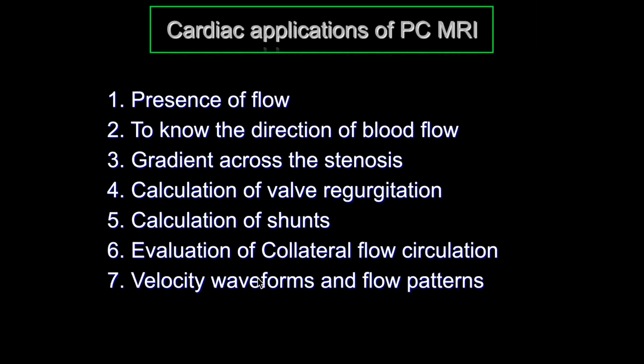So the second question on the same lines is, what about when you have complex procedures, for example post-operative Fontan or Glenn or any of these other complex procedures? In that case, how do you start off with the Venc assignment, and where do you actually measure it?